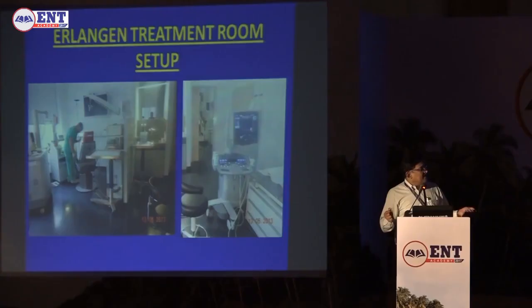And this big machine here is called a lithotripter, called mini lith. Unfortunately, it is not being made anymore for salivary endoscopy. The company found that there are too few buyers, so they stopped making it. So we don't have lithotripters of German make. We have some Israeli manufacturer which will only shake the stones, won't powder it. So probably it's not worth it.